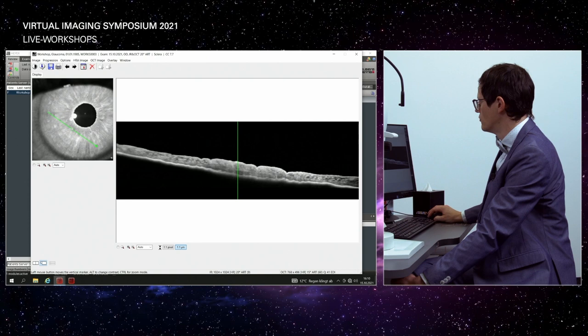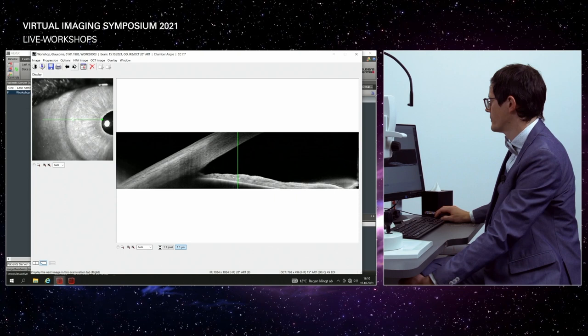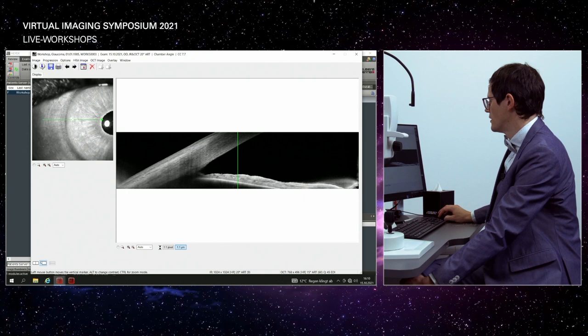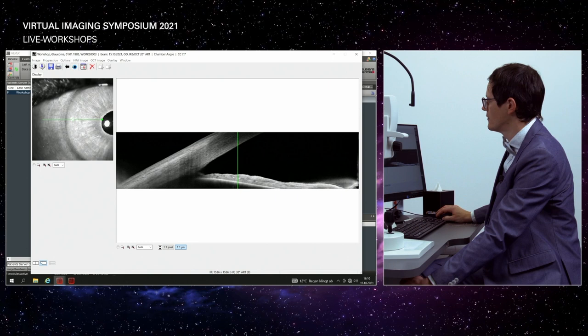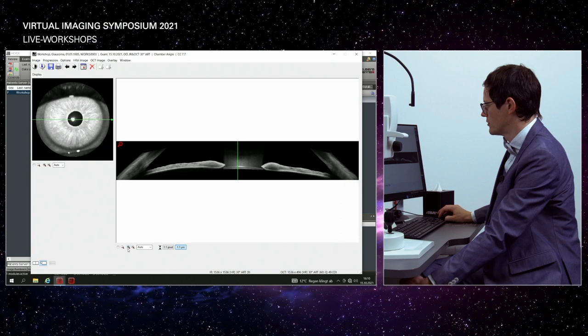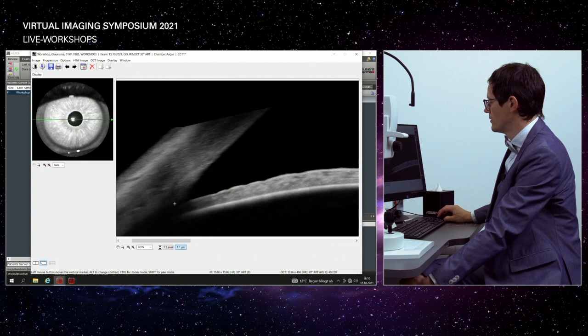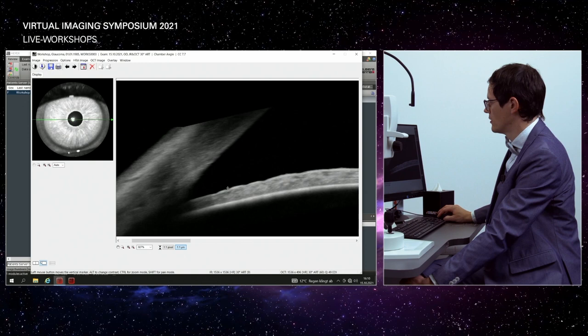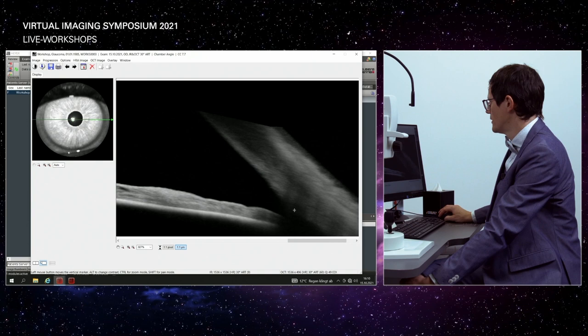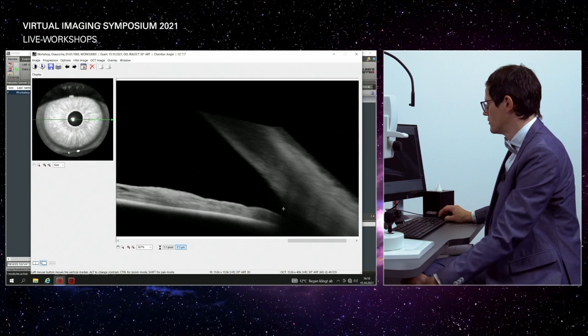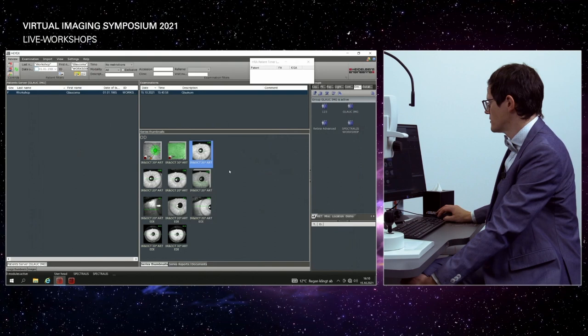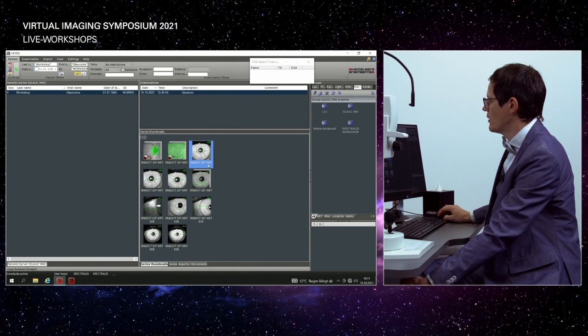In the anterior chamber angle measurement, you can see how nicely we can image the anterior chamber. I would enlarge the scan and place measurement points on the scleral spur, the back side of the cornea, the anterior chamber angle recess point, and the front of the iris to assess the angle width. With experience you can estimate the angle — for this patient it looks to be between 30 and 40 degrees. Now I'd like to move to the glaucoma software analysis.